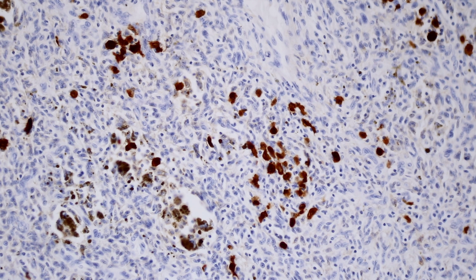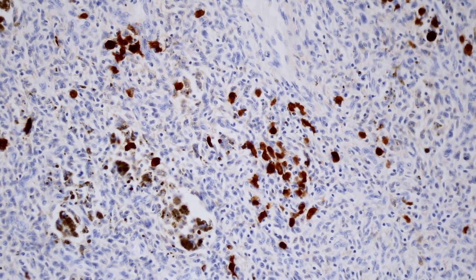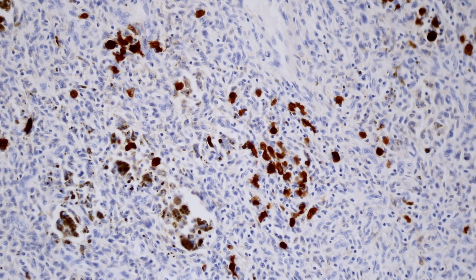And in these aneurysmal type dermatofibromas, the ones that have abundant foamy histiocytes, they tend to also have abundant S100 positive dendritic cells, and they can cluster. And I've seen cases where they really pooled together in the blood-filled spaces and really mimicked S100 expression in tumor cells. That's relatively uncommon, but just know that S100 positive dendritic cells tend to be more abundant.